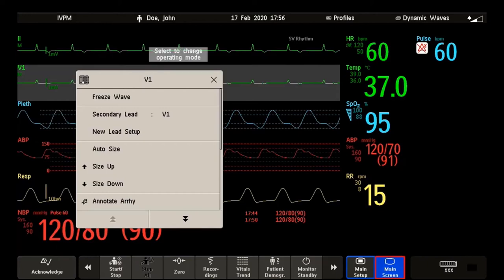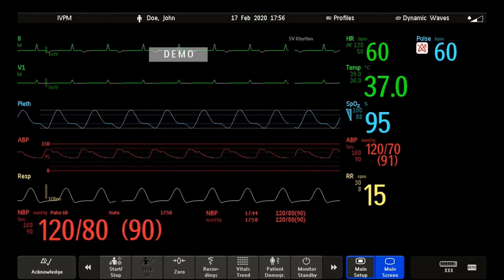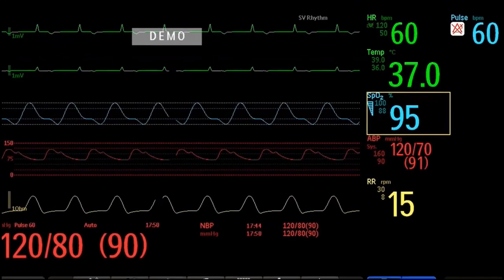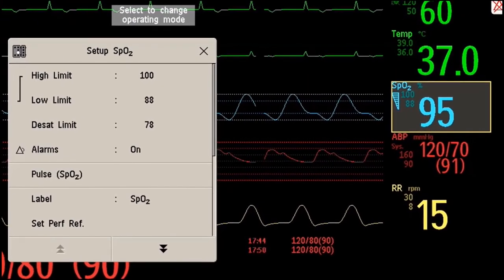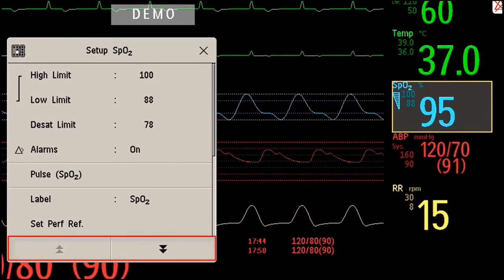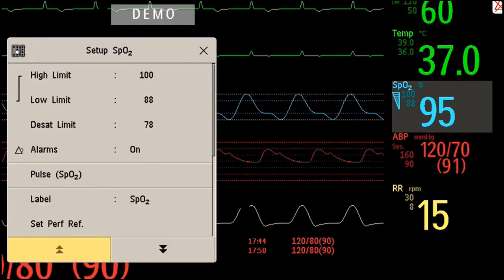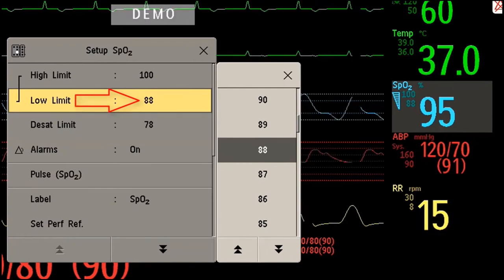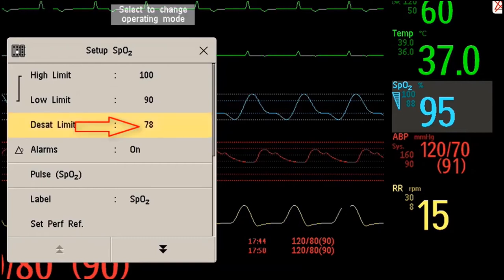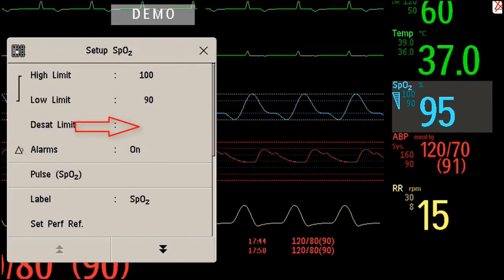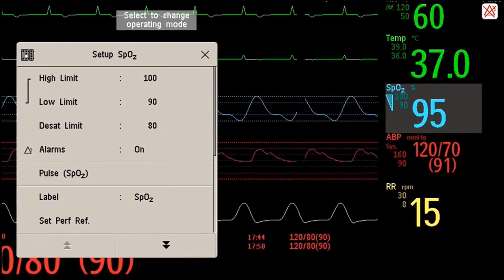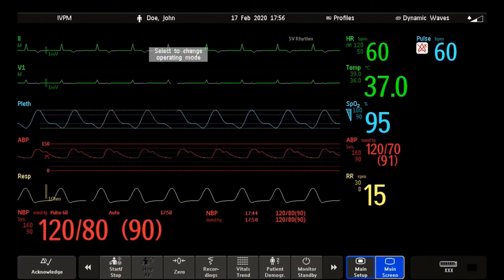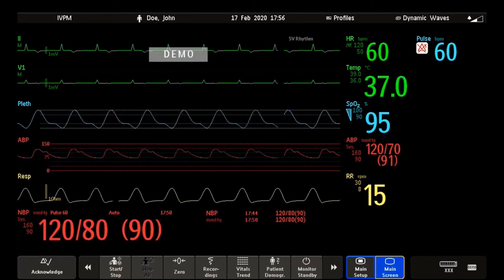Note that you don't need to close a window before you can open another one — simply select another screen element. Here you see the SPO2 setup menu. In the menu, you can scroll down and up using the arrows. I now want to adjust the lower alarm limit and the threshold for the desaturation alarm. I have now selected the new alarm limits and I can close the menu. There is no need for additional confirmation. If you need to learn more about alarms in your Intelliview patient monitors, watch the alarm management tutorial.